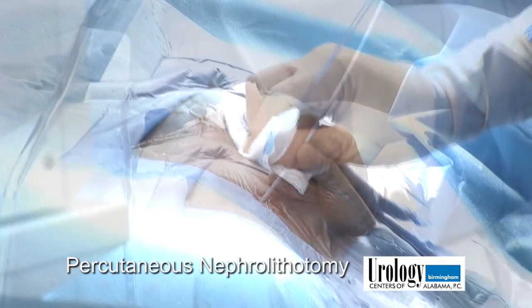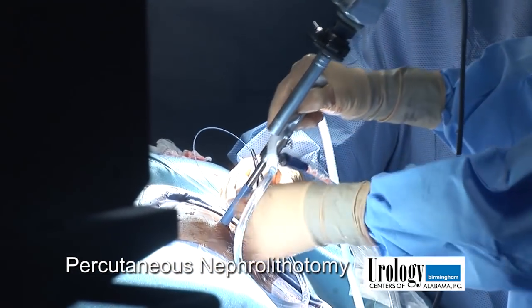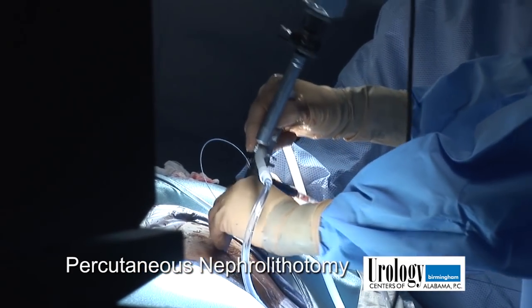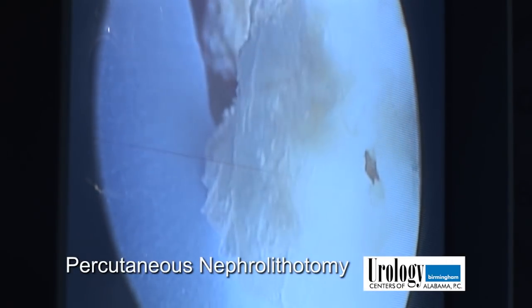We're ready for the ultrasound. All right, now we have our stone in view, so we're getting ready to break it up.